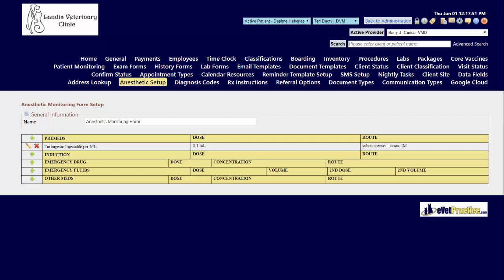To add an item to be pre-populated so that it is immediately available whenever you go to fill out and use the anesthetic monitoring form for that particular section, click the green plus icon.